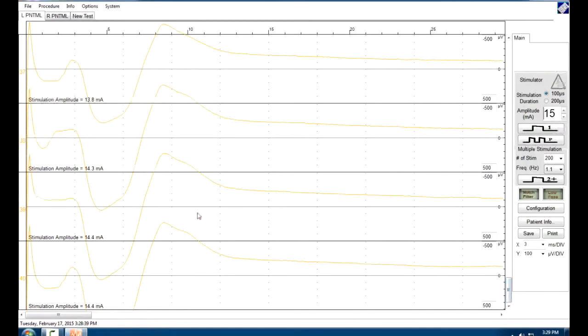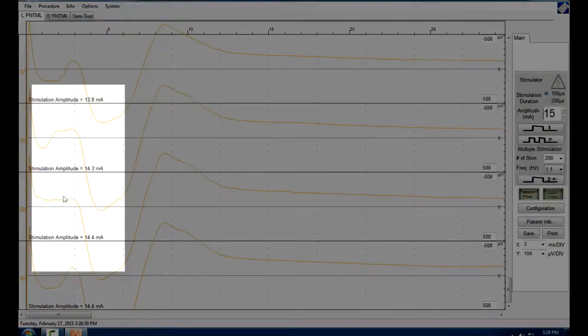Since we're here on the left side, I recommend that we just go ahead and mark our electrodes right now. I'm going to pick these two right here in the middle. I'm going to do a right click inside of this particular channel, and I'm going to enter event 1. I'm going to grab that event marker. I put the mouse over the top of it and do a left click. It grabs it and moves it.